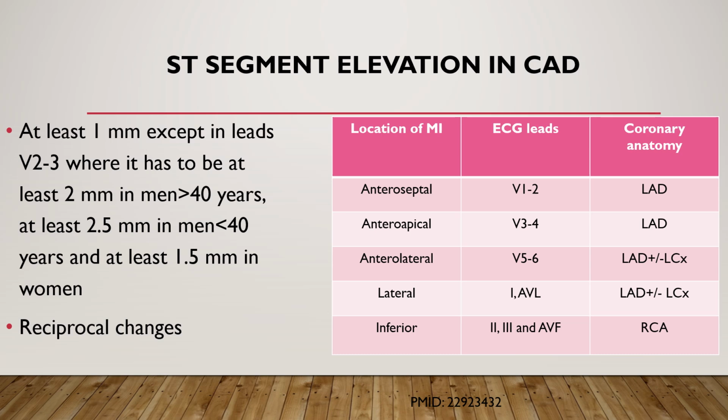Pay attention to this table on the right side of the screen. It shows you different vessels involved for different areas of MI or myocardial infarction, and typical EKG leads where these changes are present. Again, this is a testable topic, and please spend an extra second or two reviewing this table.